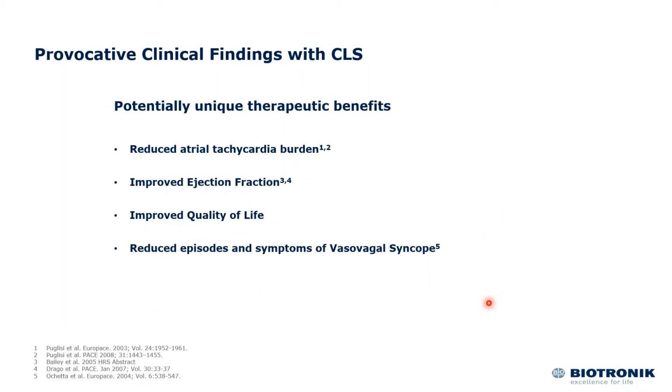So having said that, we already went through the CLS concept, and the CLS being used in the real clinical setting. So how do we utilize CLS pacemakers? There are many settings that we can utilize, but I'm just going to dwell on basically two. In patients with sinus nodal dysfunction with concomitant atrial tachyarrhythmia, CLS has a very good usage. And of course, the other one will be CLS pacemaker usage in vasovagal syncope. So this is something that I'm going to dwell on.